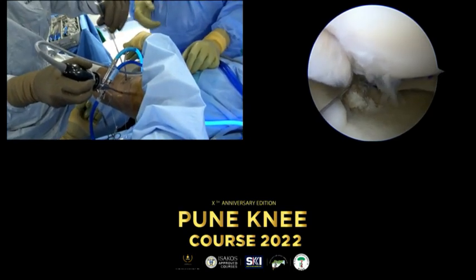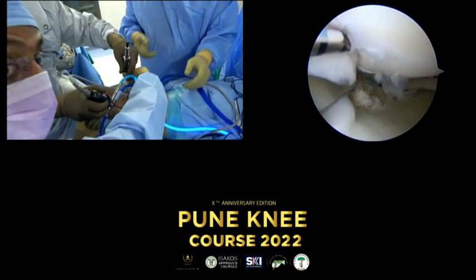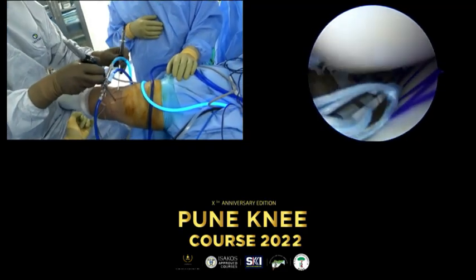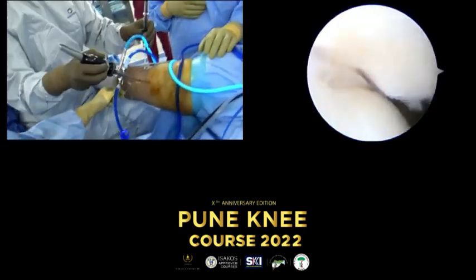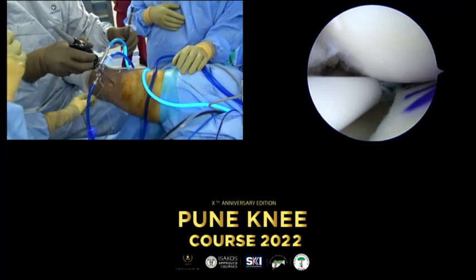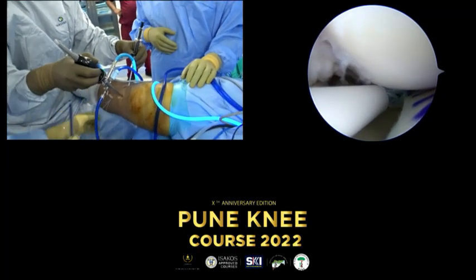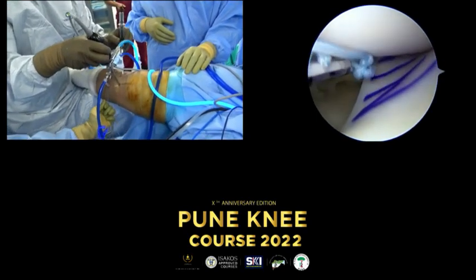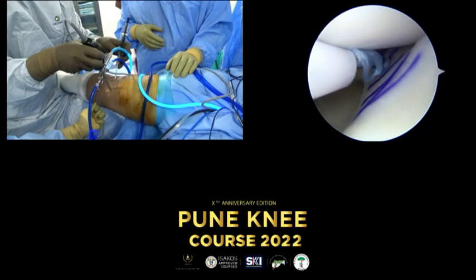He's doing all his, so he doesn't take this. You can take out the lid. Excellent. The angulation is not the nicest one. You can bend it a little bit, I forgot it. Probably I will place another one. Can you pull from the posterior insertion? No, the posterior, exactly, yes. There we are. We will put another one. We will bend it slightly.